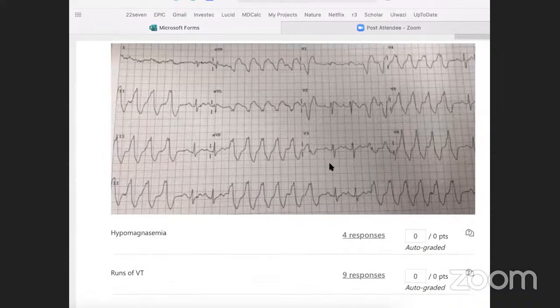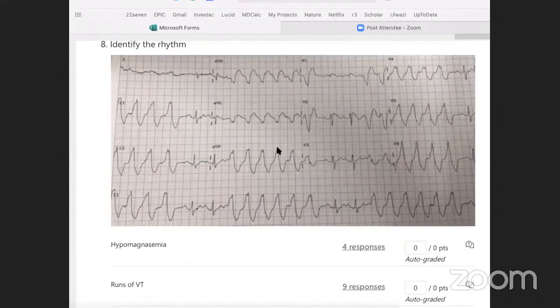However, the correct answer, a technique when we have very bizarre beats, we know that these are ectopic, broad, bizarre, wide, and then we can see that there is capture again. So we have a P, QRS, there's our T wave, we have a P wave, QRS, and then it starts again, and we get these sort of runs of ventricular tachycardia. And the key when we see something as bizarre as this is to look where there is no noise.